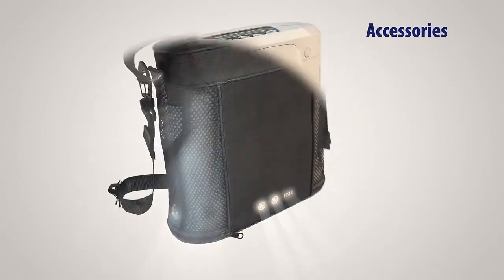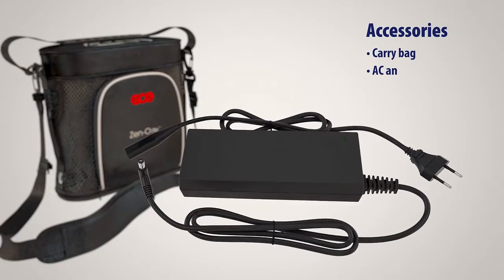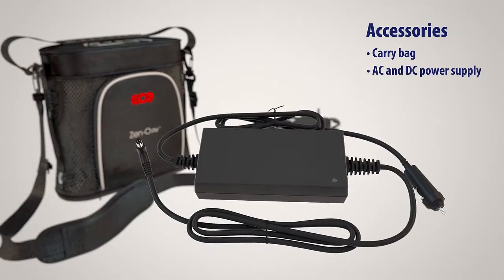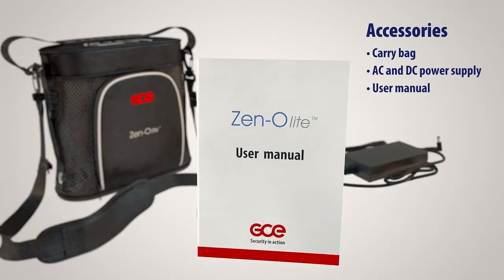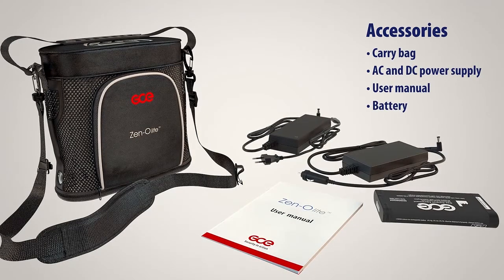Zen-O lite is supplied with a stylish carry bag, AC and DC power supply, user manual, and battery. A customised rucksack is available as an optional extra.